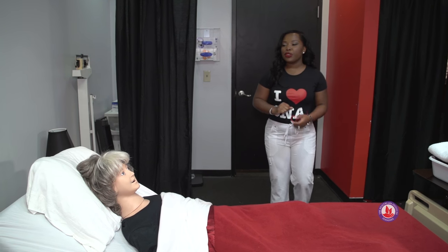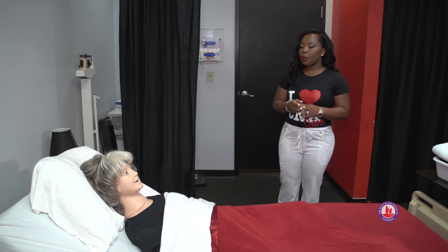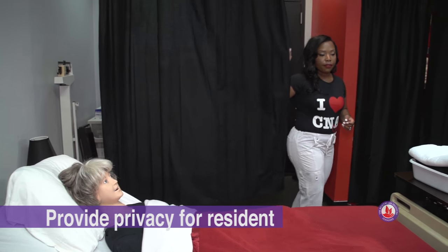Good morning, Ms. Dolly. I'm Katrina, your CNA today. I'm going to be doing your catheter care, but first let me wash my hands. So I'm verbalizing washing my hands. Then I provide privacy for the resident.